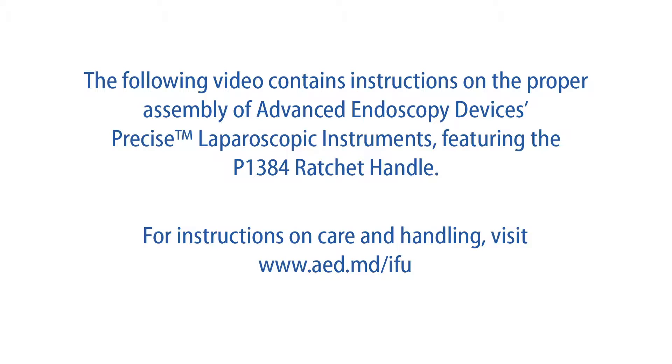The following video contains instructions on the proper assembly of Advanced Endoscopy Devices Precise Laparoscopic Instruments featuring the P1384 Ratchet Handle. For instructions on care and handling, visit www.aed.md/ifu.